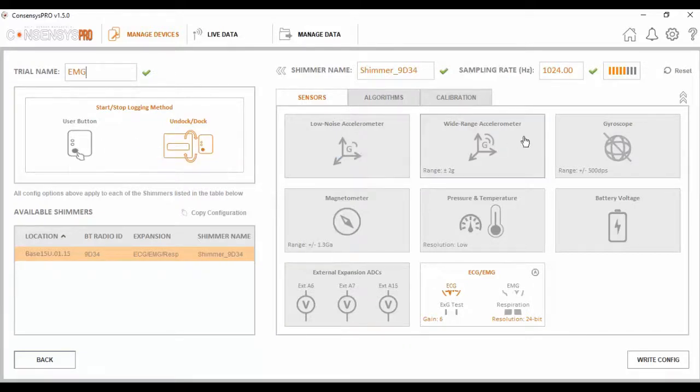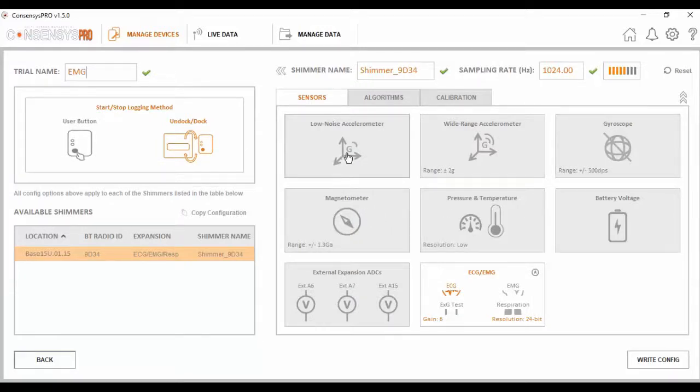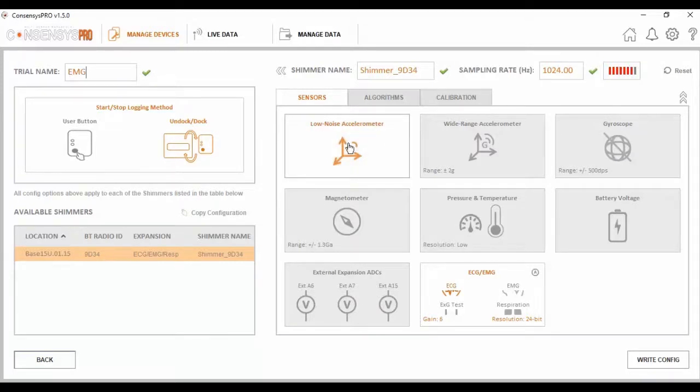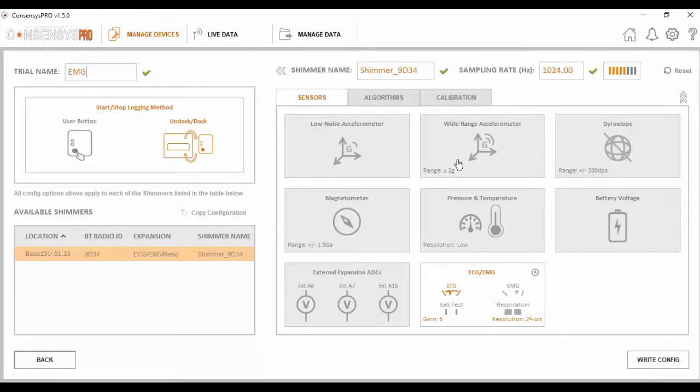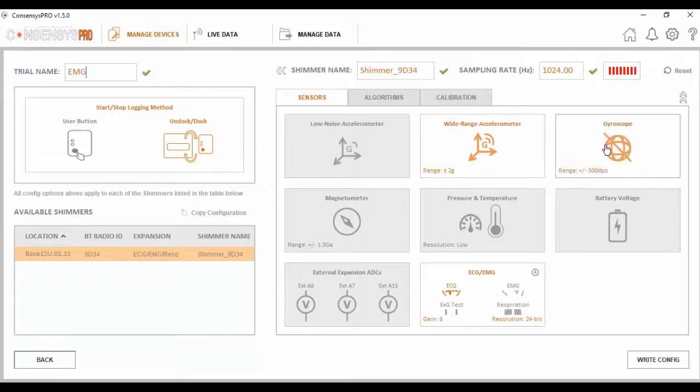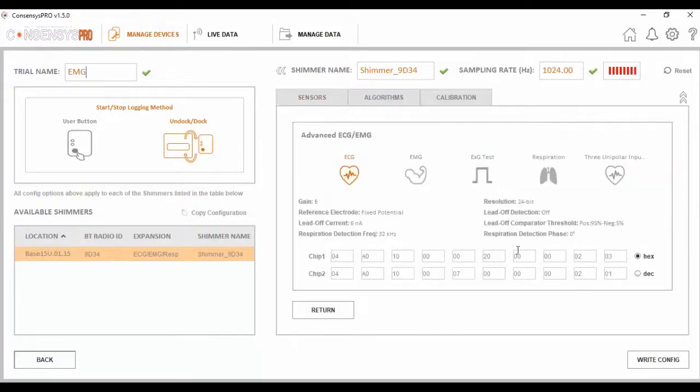Next, I need to decide what signals I want enabled for my trial. This is done by highlighting a particular signal. If it's greyed out, it's not enabled. If it's highlighted, it is enabled. The range can also be set on these signals. For the purpose of this trial, I'm going to use wide range accelerometer, gyroscope, and EMG.